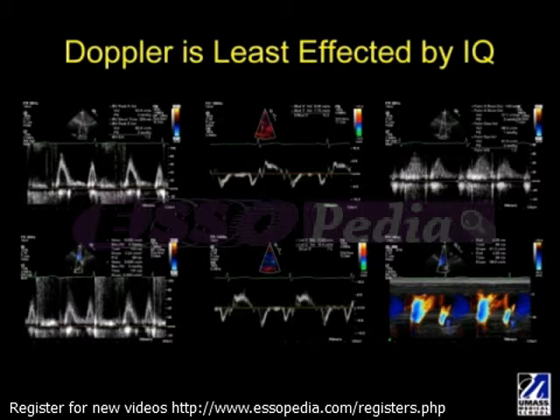So look what I teased out in this example. You see that the mitral E wave is about as good as it gets, with nice crisp peaks and a nice clear deceleration time. The peaks are well defined, and the mitral inflow is easily measured. I then shift the sample volume slightly towards the annulus and drop the filter slightly, and we get a nice measurement of the A wave duration. If we move further on to the Doppler tissue imaging, you see that the E prime in this example is just 8 centimeters per second, and the E to E prime ratio equals 10.